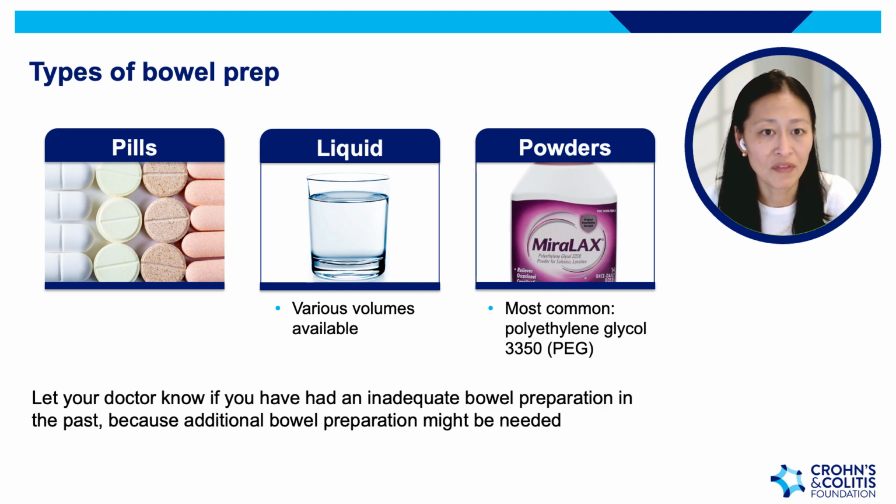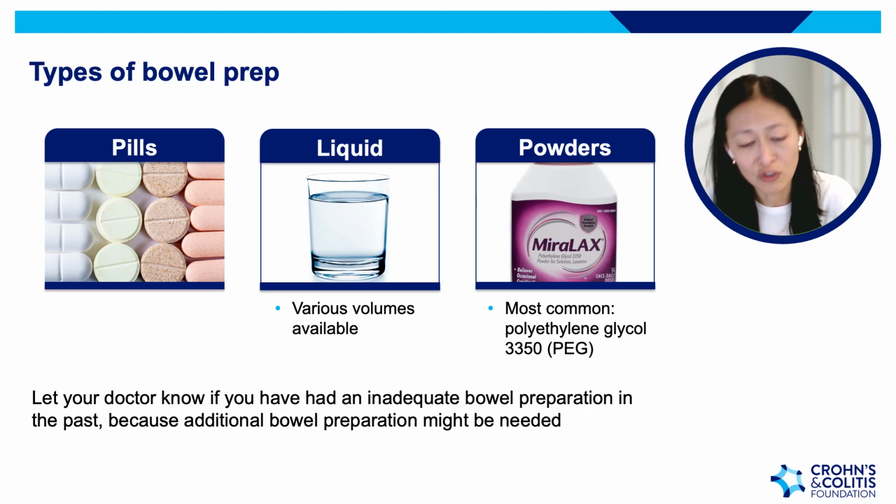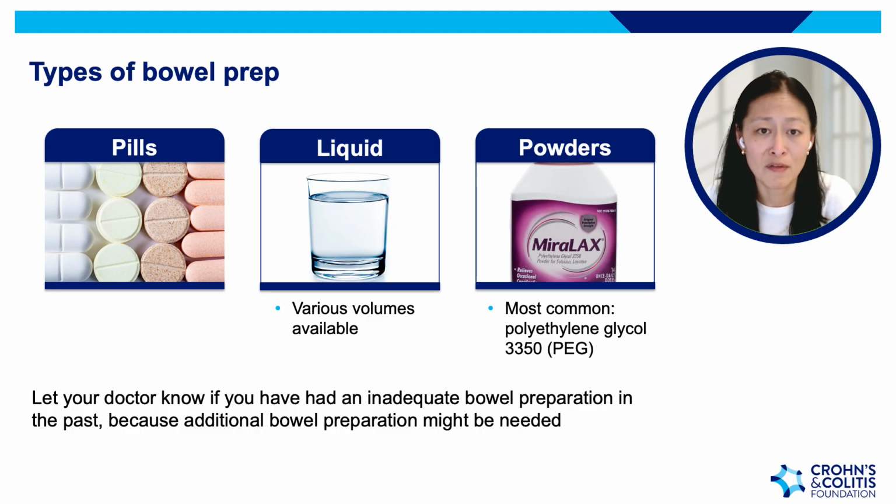So, another important thing to say is if you have in the past had an inadequate bowel prep or a dirty prep, talk to your doctor about what happened last time and solutions to avoid that happening again. Sometimes we start the prep earlier, sometimes you might need a multiple day prep, but your doctor should be able to brainstorm with you about what makes sense to try next.